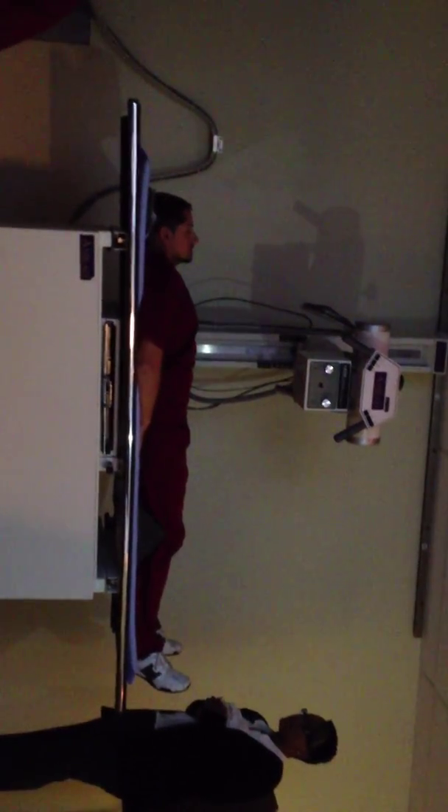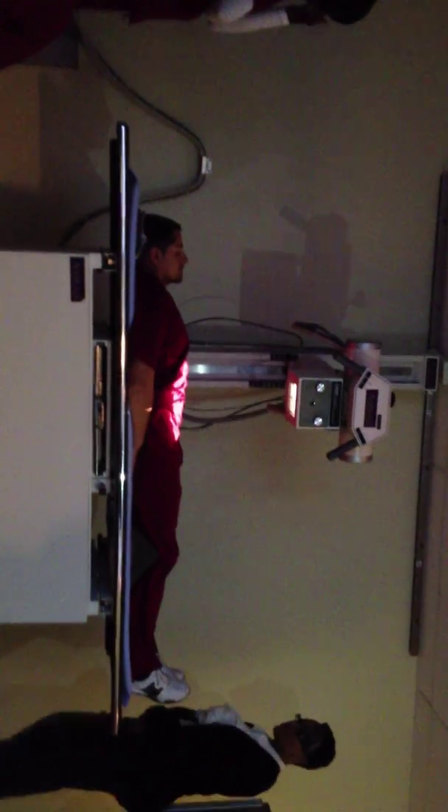You want to go to the head or foot and look at your light field, because you want to make sure it is equally down the center of the body. Sometimes you'll need to fully straighten the patient so you can see. You can see better from the head or the foot, and if you see that you need to make changes you'll notice there's not equal light on both sides.